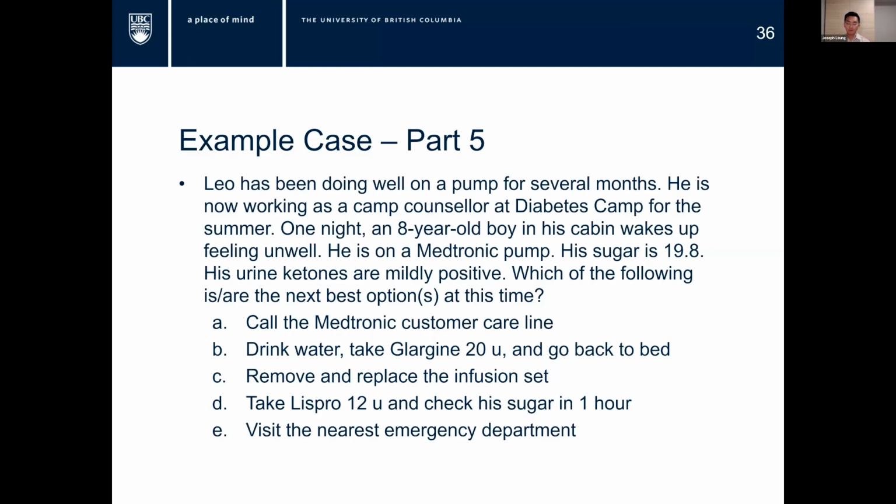You can pause this video and think about this. You can call the Medtronic customer care line, drink some water, take some long-acting insulin and go back to bed, remove and replace the infusion set, take some short-acting insulin by injection and check his blood sugars in 1 hour, or visit the nearest emergency department. You can think about that for a little bit.